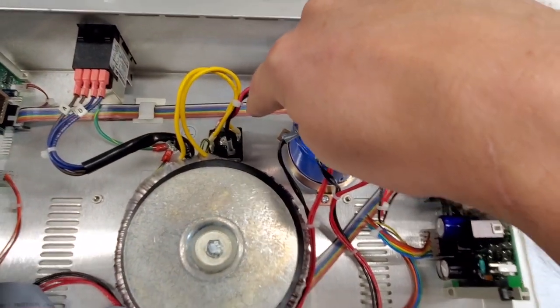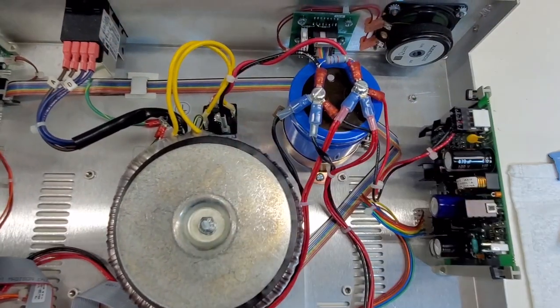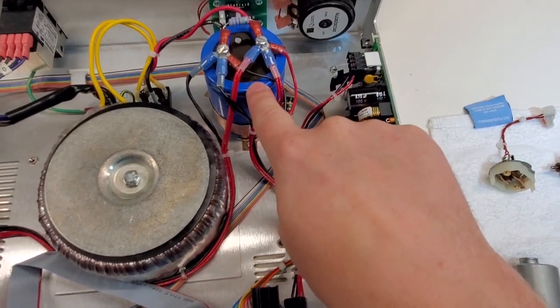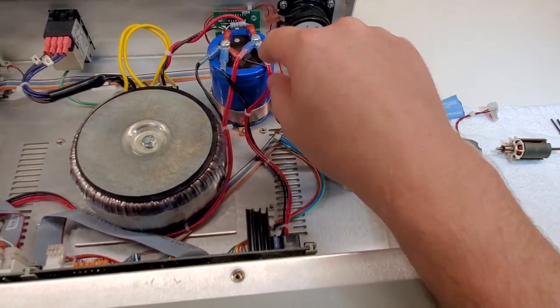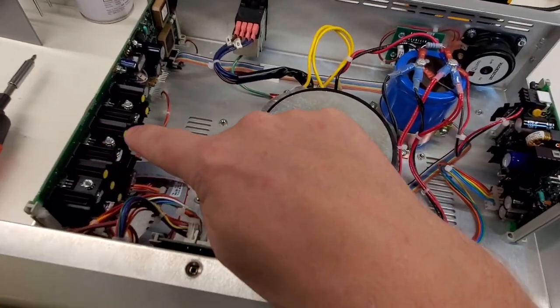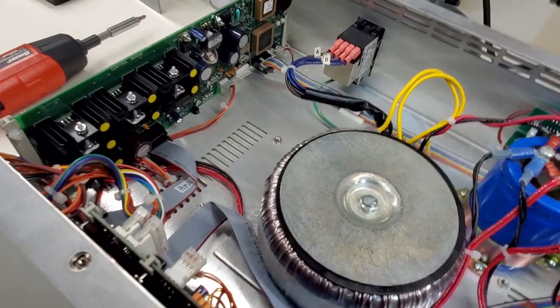Down here you can see we have a bridge rectifier mounted to the base pan using the chassis of the equipment as its heat sink. Comes over here into a smoothing capacitor, and from there, voltage splits off. It goes over here to the handpiece driver board and control board.